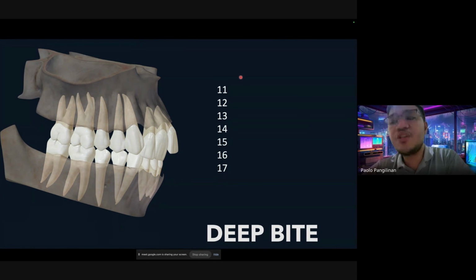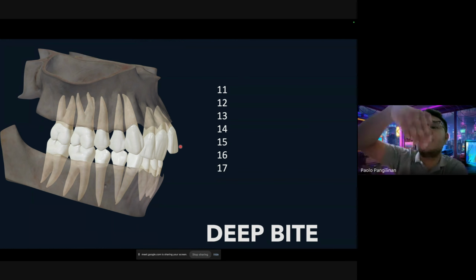Staging in this context is, let's say you have a deep bite. Now, what happens on clear aligners is the usual deep bite staging, or sorry, let's go first to your fixed appliances. When you place a round wire on this kind of case, what happens first, right? You place a round wire, and it proclines.